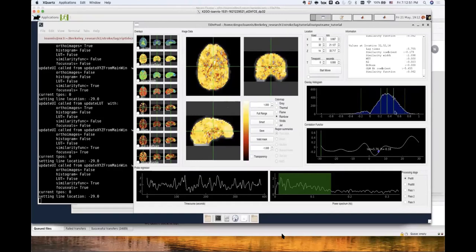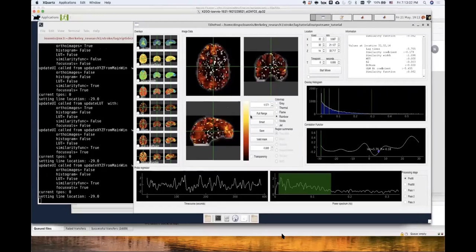Again, this is the distribution of the voxels. One can, for example, look at the R squared, which is the R squared metric of how well the regressor fits the data. One can look at the GLM coefficients. Actually, I'm not sure if I showed them before, but these are the GLM coefficients, meaning what the coefficients are after you fit the regressor to your data. And again, the distribution is shown here.